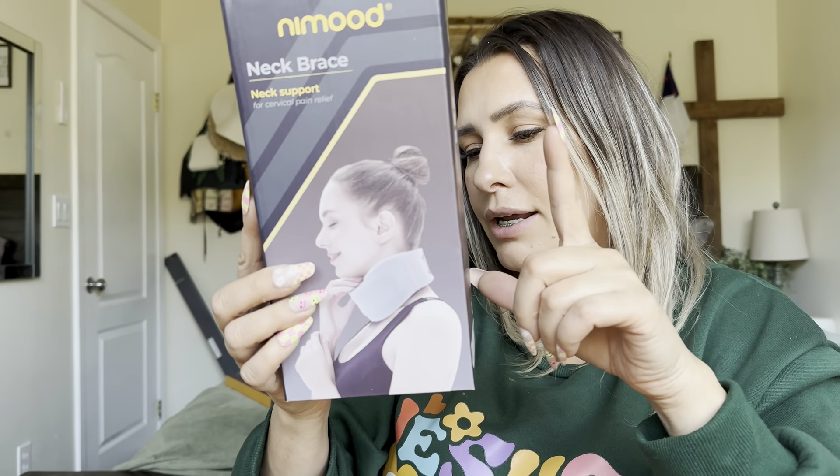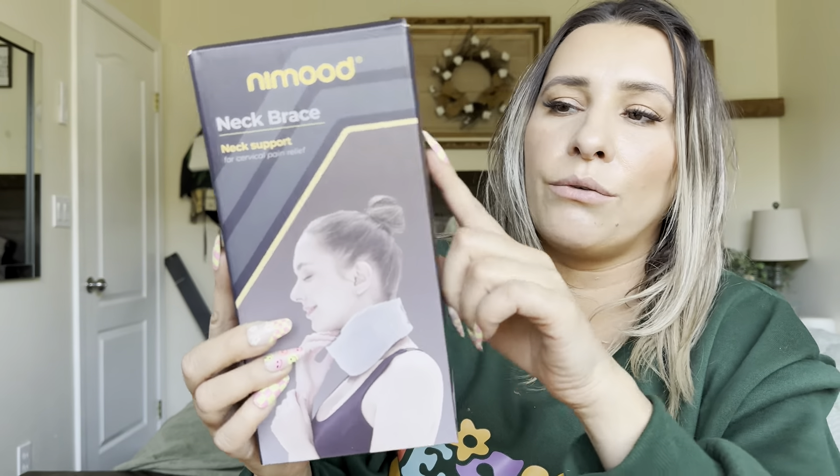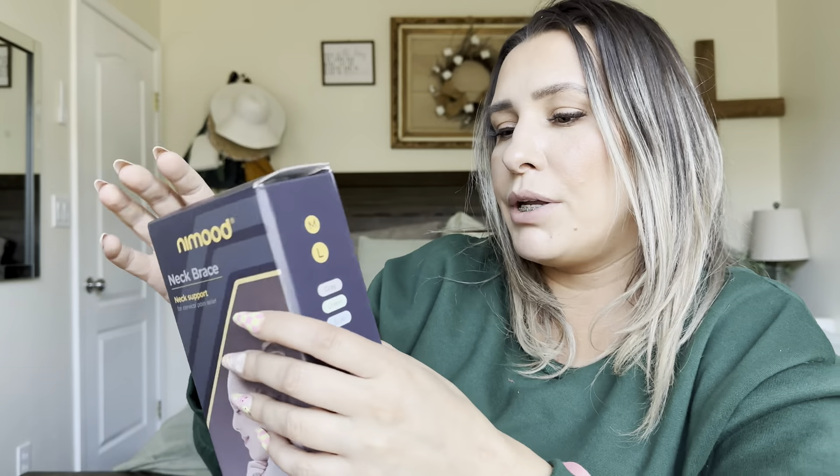I did get it in a size large and gray, but it also comes in medium or large, and it comes in gray, green, and blue. Let me go ahead and just show you what it looks like.